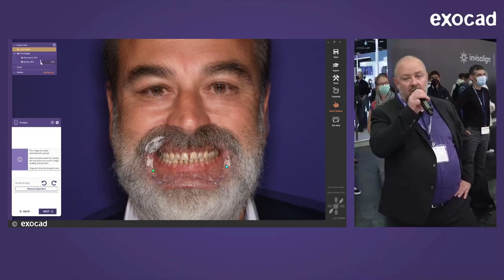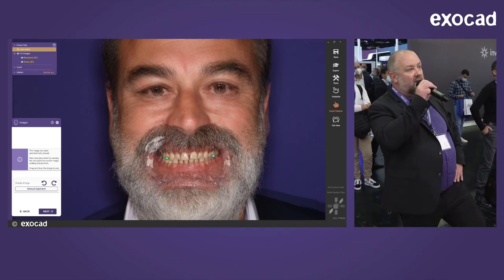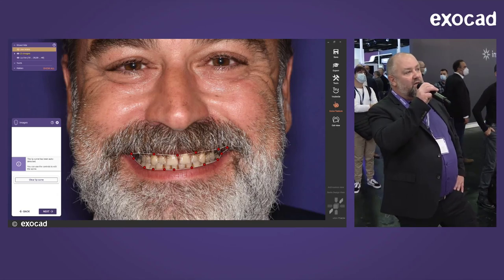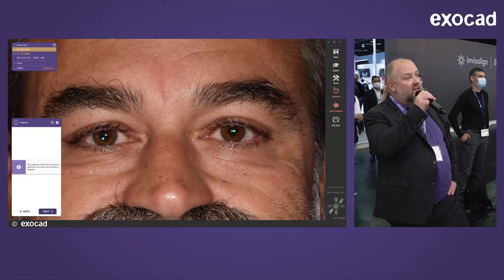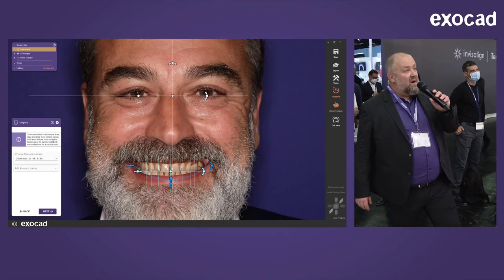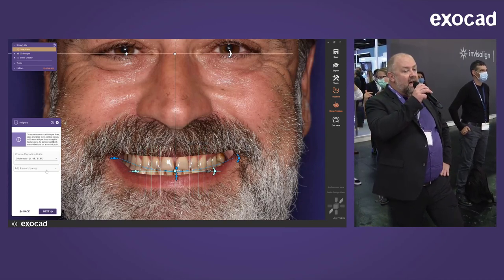During programming, we put data of hundreds of patients into the software to make it learn. The software uses references in the pictures — the teeth are the best reference to align them. In the next step the software detects the lip line automatically, and in the third step AI is used to detect the eyes, defining the bipupillary line so the picture is oriented horizontally. Then you can add helper lines, proportion guides, golden ratio, smile curves, vertical and horizontal lines.